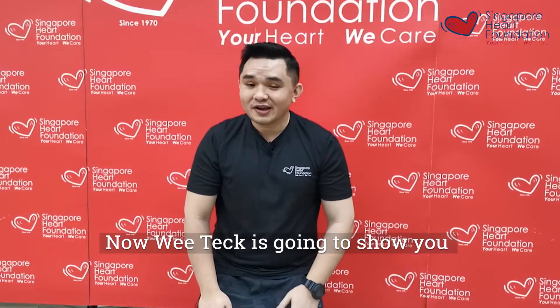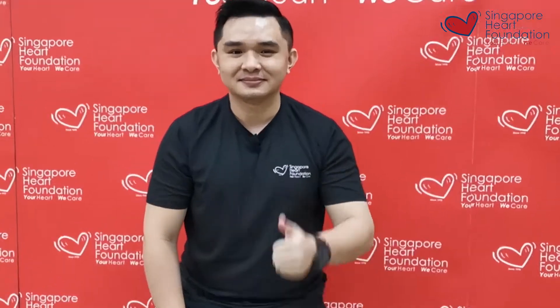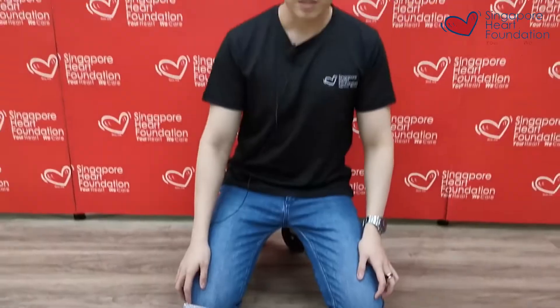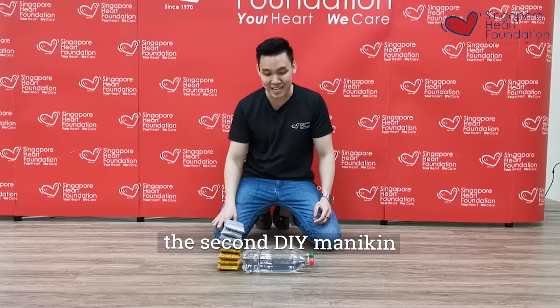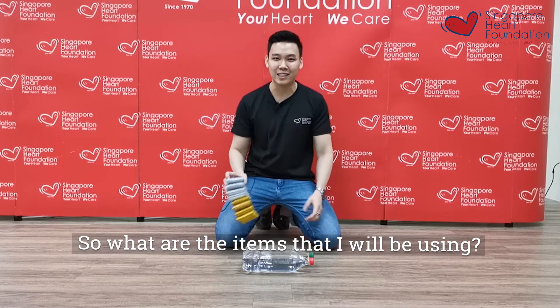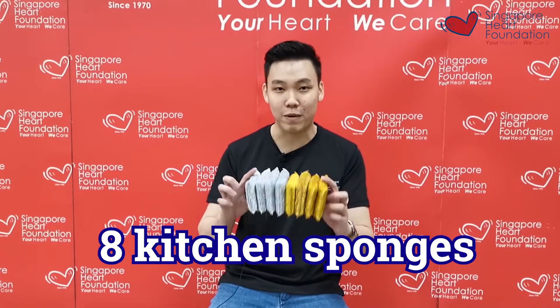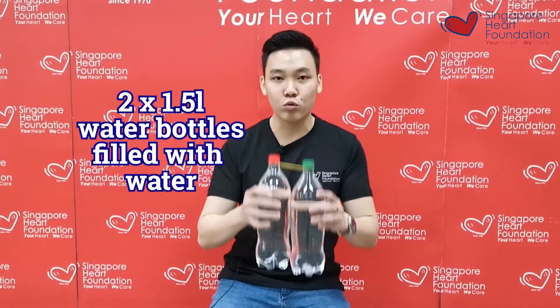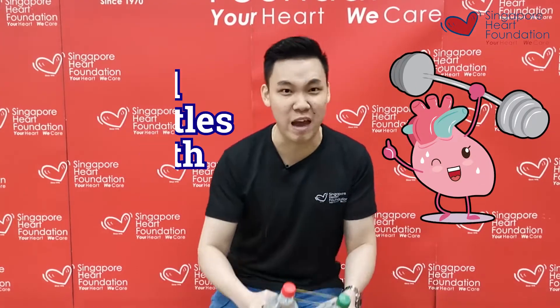Hope you have fun. Right now, Vitek is going to show you the second set of DIY mannequin. I'm Vitek, I'm back again. I will show you the second DIY mannequin. The items I'm going to use are: first, kitchen sponges with multiple sponges together; and next, two 1.5-litre water bottles filled with water — you can also use them as carry weights.